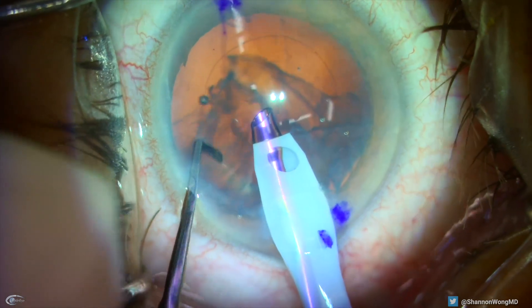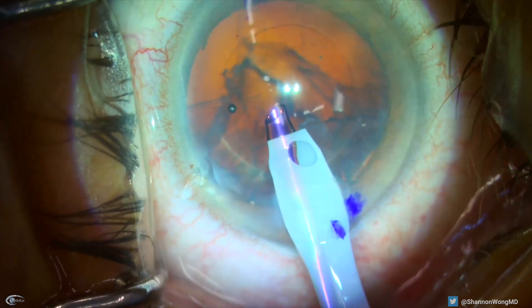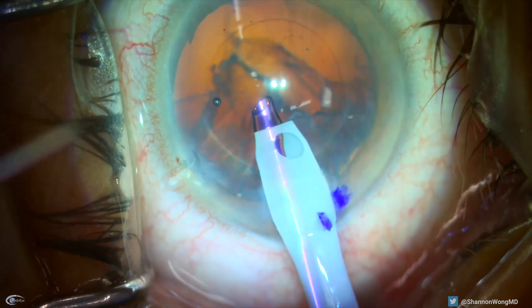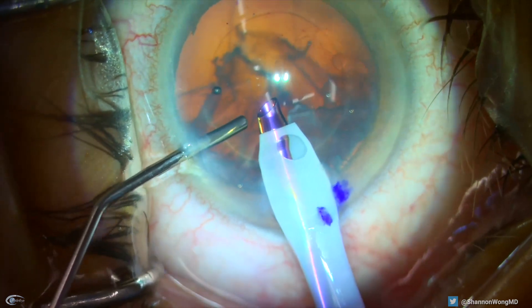Once I have the nucleus out, I keep the phaco infusion on and ask for some viscoelastic to stabilize the anterior chamber and hopefully keep the vitreous from prolapsing into the anterior chamber.